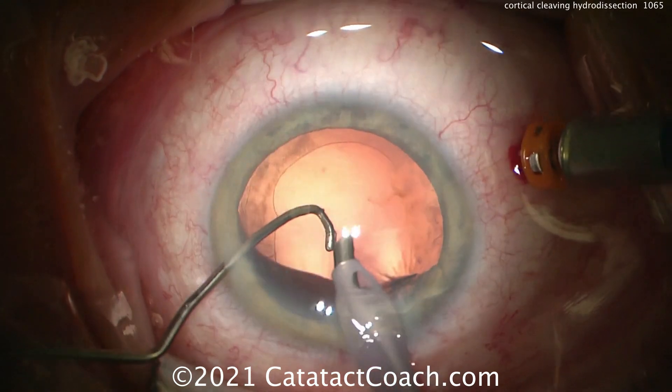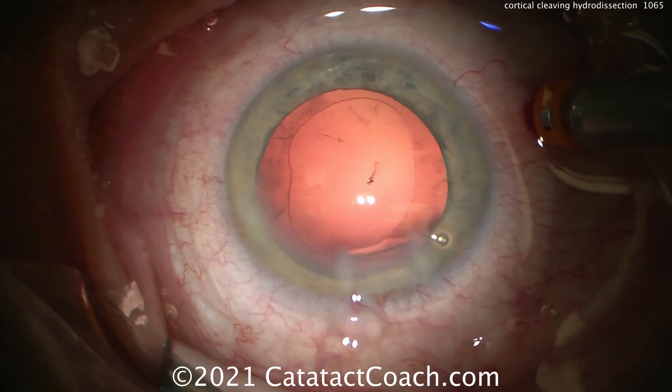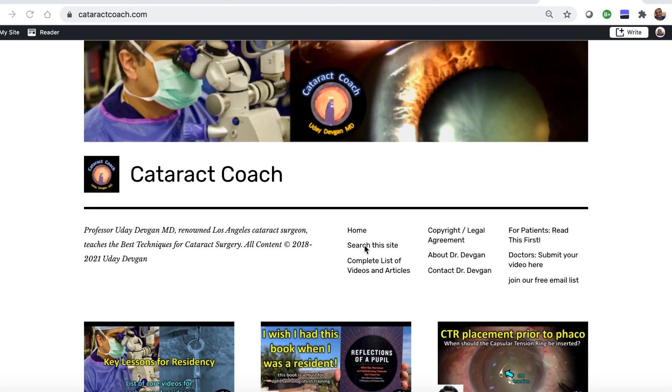The only disadvantage I can think of is that when all the cortex is removed, there's nothing weighing on the capsular bag, and you may have more mobility in that capsular bag. But with good parameters, you're safe.